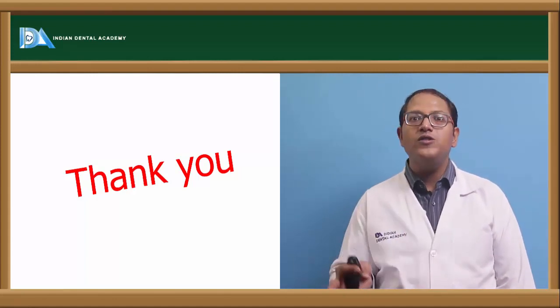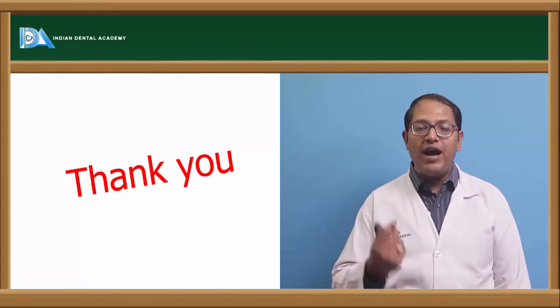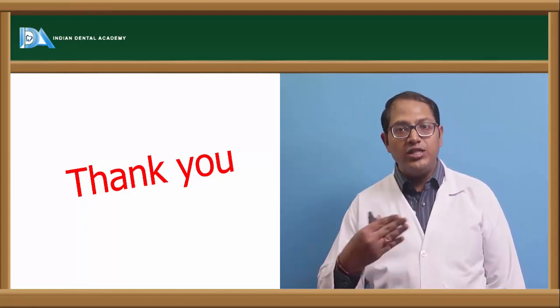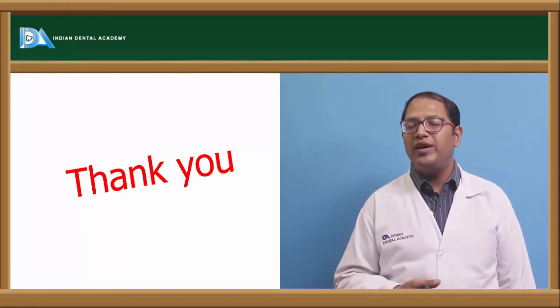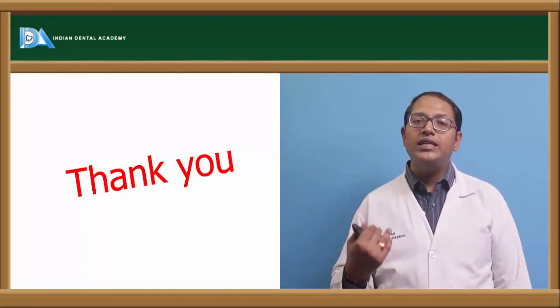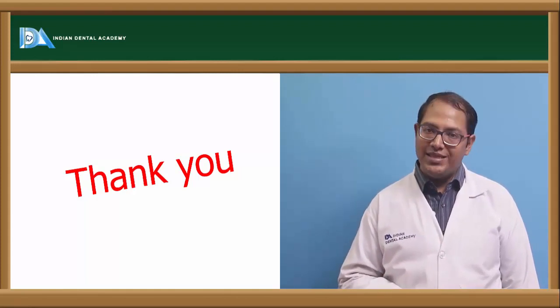Based on all those factors and the edentulous and tooth evaluation, we will decide which major connector, which minor connector, where the rest should come, where the primary and auxiliary rests, and where the indirect retention should be provided on the particular teeth. And of course, at the end of the day, how the denture base should be, and what kind of artificial teeth you are going to put to replace the missing teeth. Thank you.